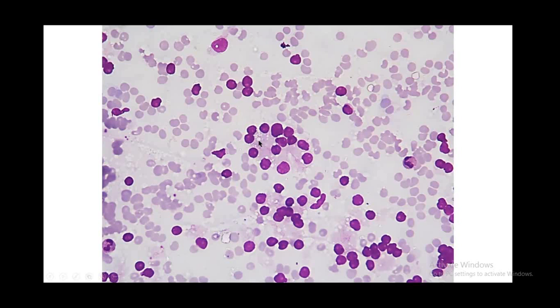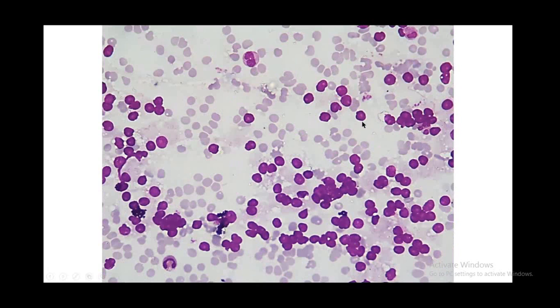had a lot of intracytoplasmic fine vacuoles, and these vacuoles were seen in the background as well. Many naked nuclei were also seen in the background.